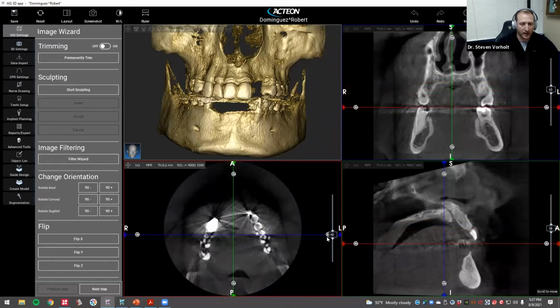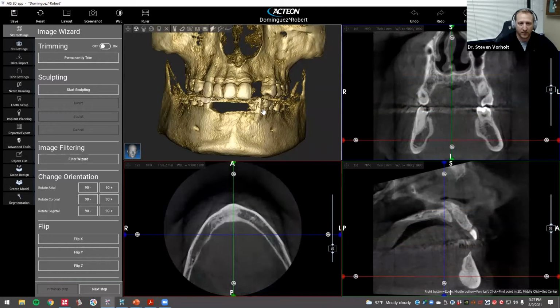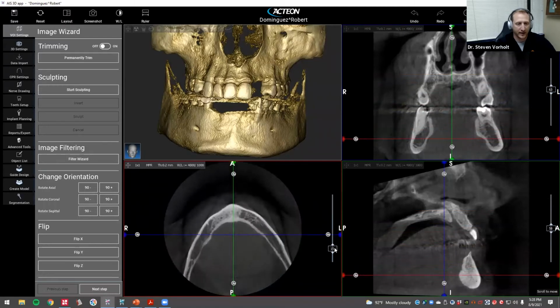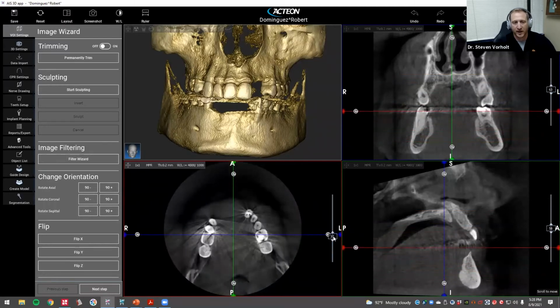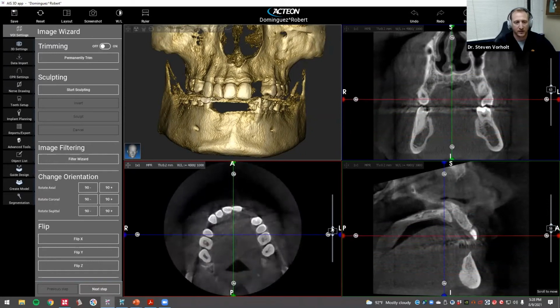As we work our way down, we're going to be looking at the mandibular teeth. Patient is also missing clearly his mandibular anterior teeth, which we did treat in this surgery as well, though we're not going to talk about that tonight. And then we're looking at any abscesses at the base of the mandibular teeth, where the mental foramen are, the anterior loop, and so on and so forth.